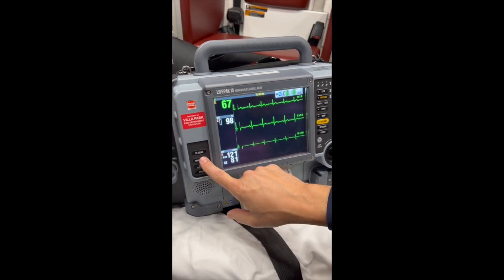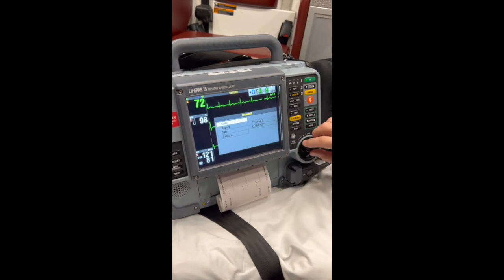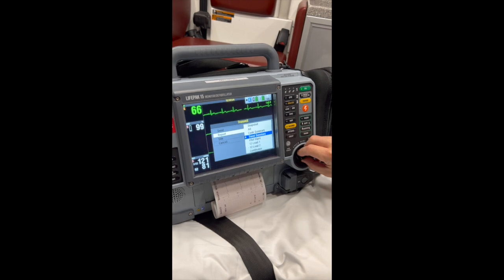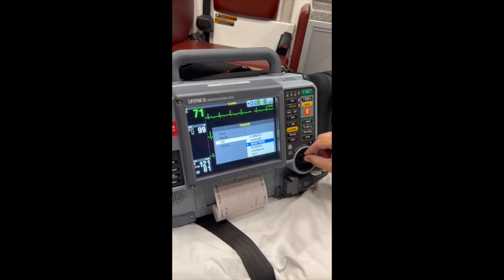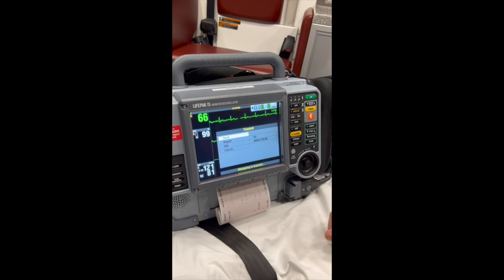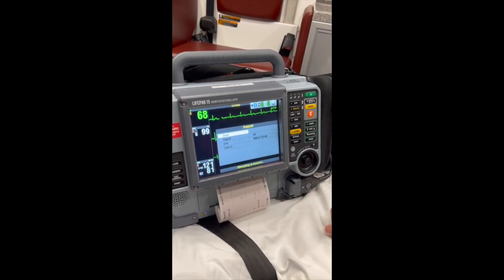Now to send things to ImageTrend, you're going to use the transmit button again. What we want to send, we're going to change the reports to all. Select that, and then the site we're going to send to is ImageTrend. Again, dial back up to send, and it's going to transmit. It'll start counting up to 99%.